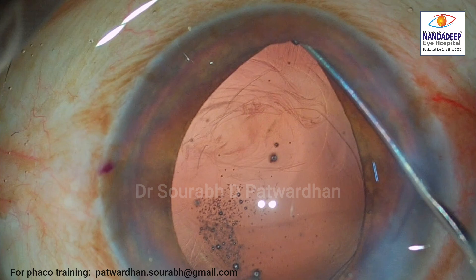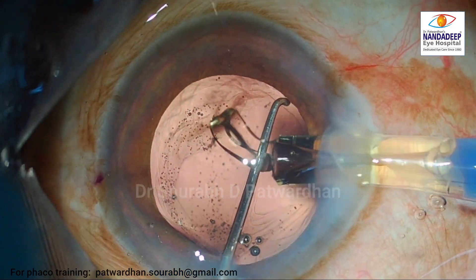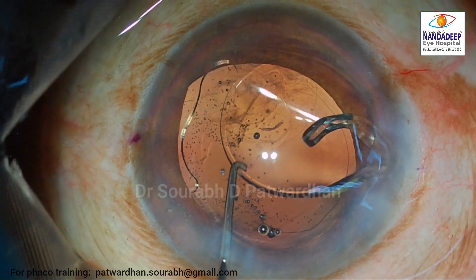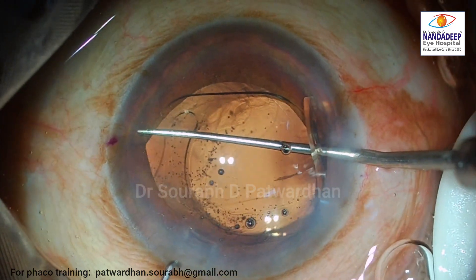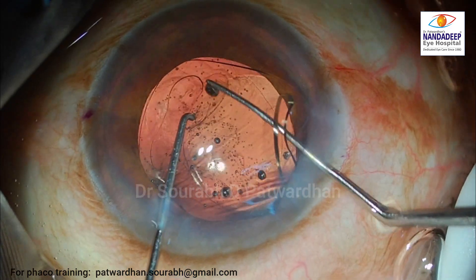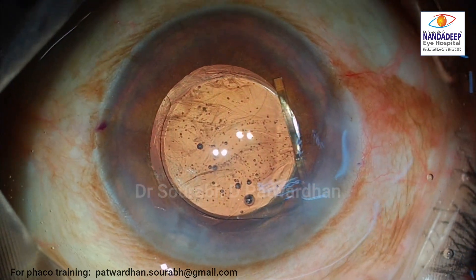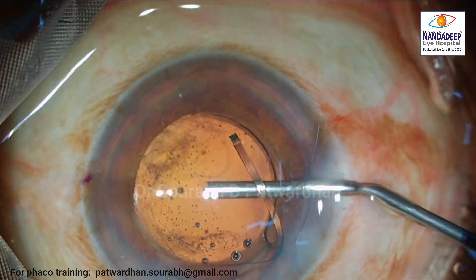The strong posterior capsule can now support the IOL even when placed in the bag. While putting the IOL in the anterior chamber, watch how my non-dominant hand holding the Sinski kept the IOL in the anterior chamber and didn't allow it to go directly into the bag. I am then using the bimanual technique to push the haptic inside the bag, taking care not to unduly stretch the posterior capsule.